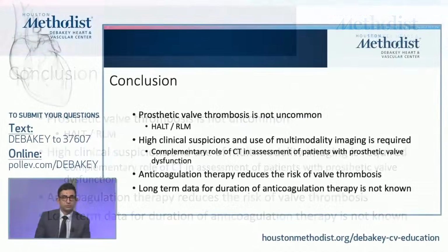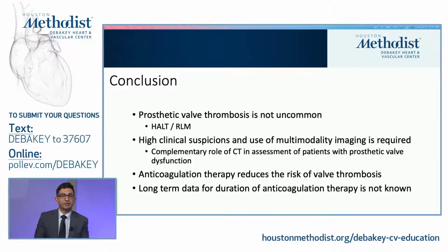So that brings us to the end of my talk. Overall, prosthetic valve thrombosis is not uncommon. The two new entities of HALT and RLM should be recognized, especially in patients who do not have any clinical findings or significant findings on their transthoracic echocardiogram.